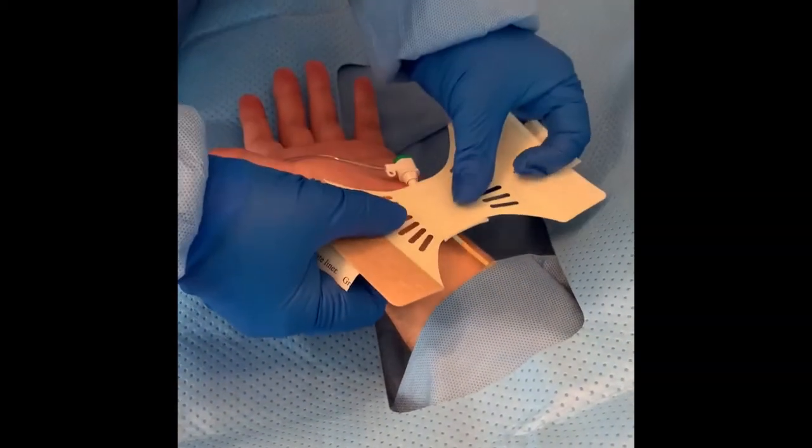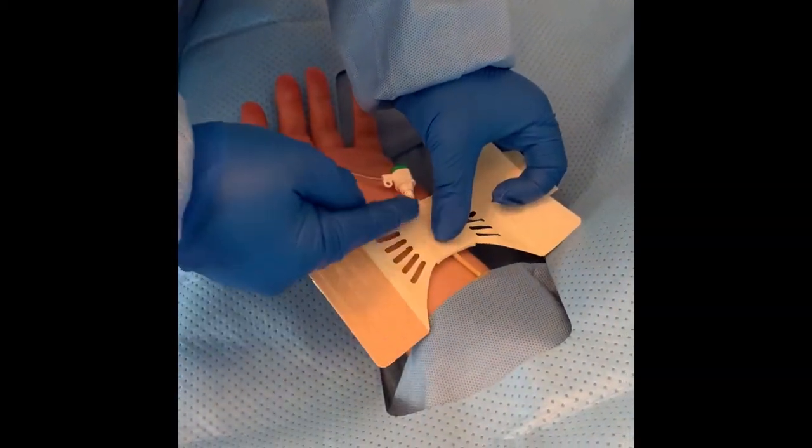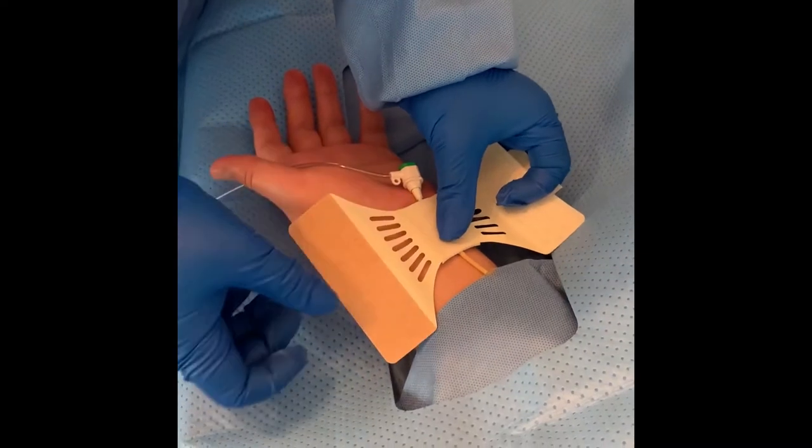Place the center of the bandage — the Telfa Pad — adhesive side down over the puncture site, using the thumb on one hand to hold the bandage in place. The Telfa Pad should cover the sheath at the puncture site and the arteriotomy site.